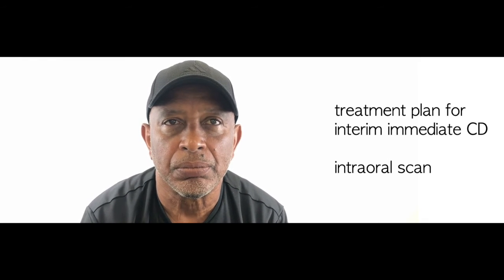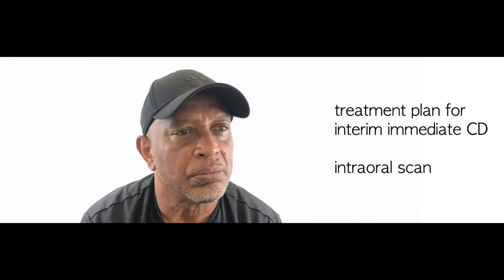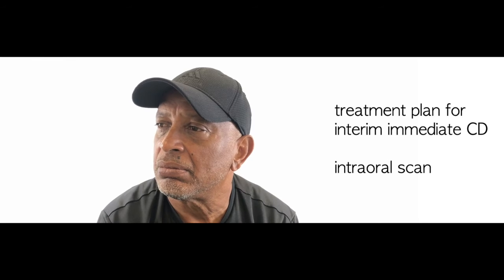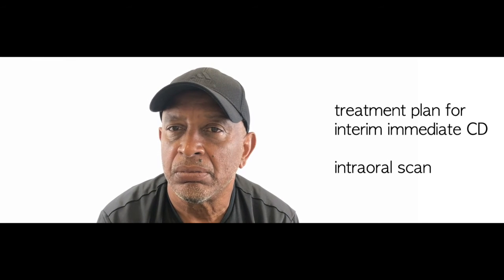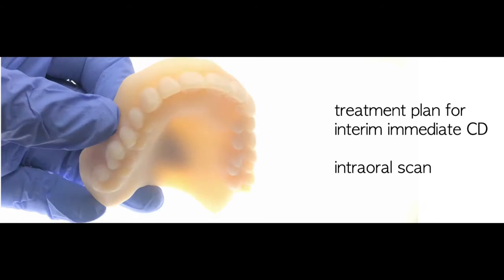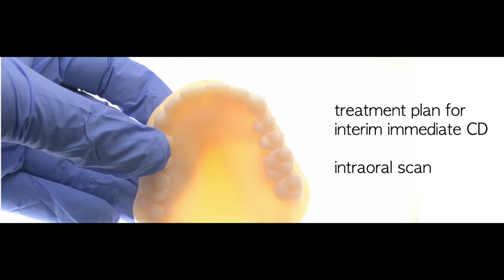And once you complete the intraoral scanning, patient will get the schedule of extraction and delivery appointment. Now, you got the design complete, and this is a try-in printed.